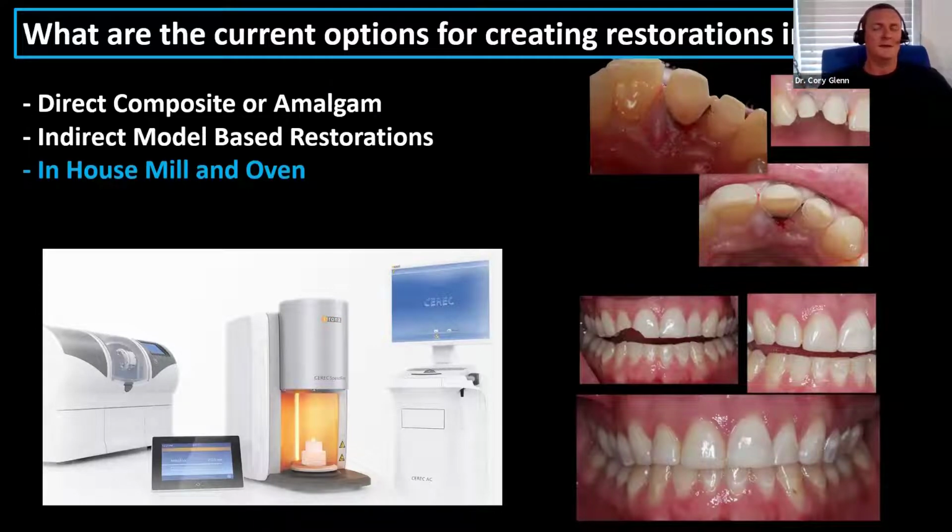I'll tell you toward the end about a new project I'm involved with, but as a preview to that, we've recently acquired some 5-axis mills from Axis Dental. Blue Sky does sell those on our website. Extremely impressive what these things can do. One of them, for example, is about $40,000, and it will do e.max blocks. It will do pucks of material. You can mill PMMA full arch. You can mill full arch zirconia. You can mill anything that you can get in a puck, full dentures, all of that stuff. And it's a $40,000 mill. It'll even do titanium pre-mill blanks.